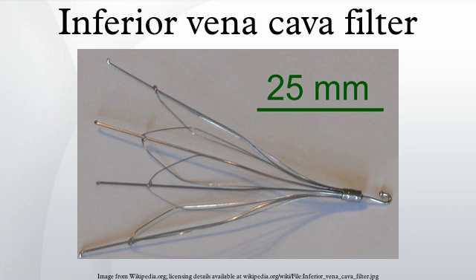In 2012, the American College of Chest Physicians recommended IVC filters for those with contraindications to anticoagulation who either have acute PE or acute proximal deep vein thromboses. For those with initial acute proximal DVT or acute PE who had IVC filters placed instead of anticoagulation, and who have their risk of bleeding resolve, the American College of Chest Physicians suggested, in 2012, that they receive a standard course of anticoagulation. While IVC filters are associated with a long-term risk of DVT, they are not, alone, reason enough to maintain extended anticoagulation.